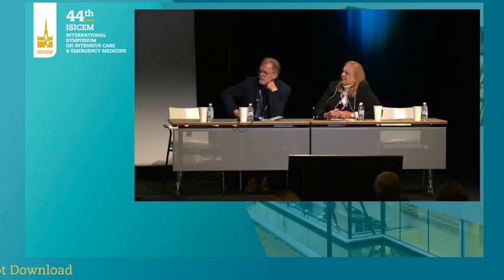Just 1 minute. And Leo, is this stimulation painful, and how long are the sessions? So the sessions are 2 times a day for 30 minutes. And as we saw in the pilot study, 87% of the sessions could be completed. A few sessions could not be completed because, especially in the end, when patients are awake without sedation on pressure support, it's uncomfortable. But if you can explain it to the patient, it's mostly not a problem for the patients.